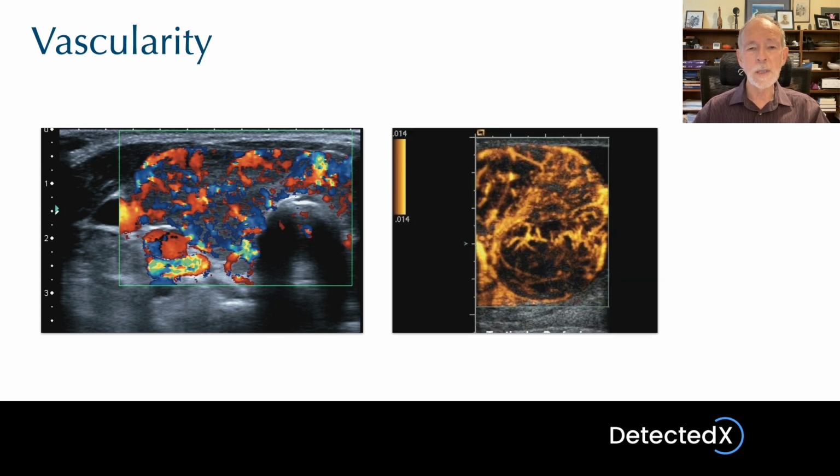Take a look at this in contrast. We have a completely different mode of Colour Doppler being used called power mode, or amplitude mode it's sometimes called. Now the reds and blues have been taken away, and we're simply looking at a scale that goes from black, orange, red, all the way to yellow, and that simply indicates the strength of the Doppler signal at each point.